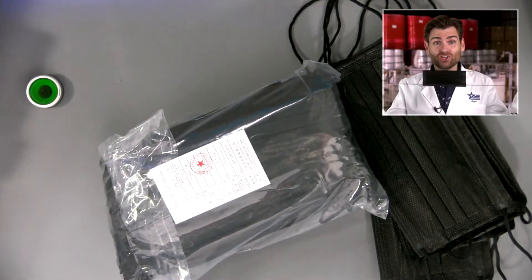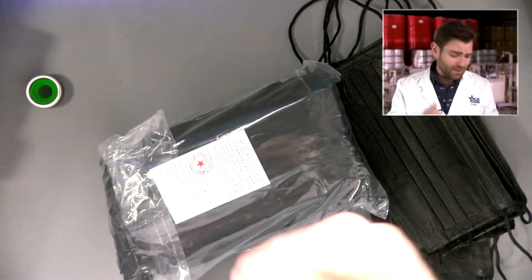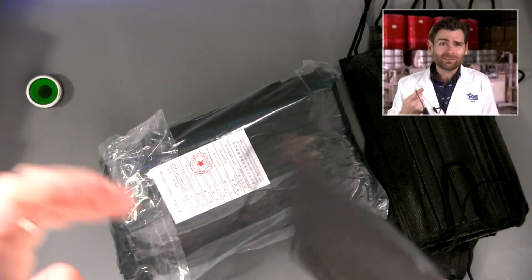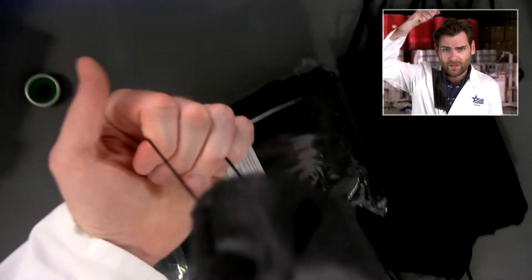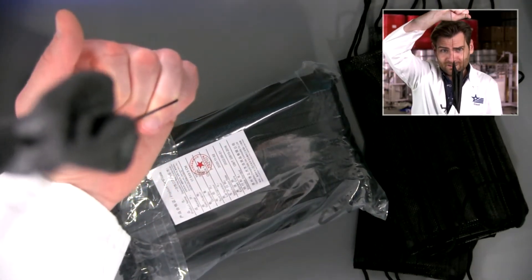Let's take some of these out. It's a black on black mask. So these ear loops are like ginormous — this is not going to fit on my face. But look at how strong that is. It broke, but I mean, you got to want that. Not sad about the construction of this mask. The ear loops are too big, but it's just falling off my face. I don't love that.